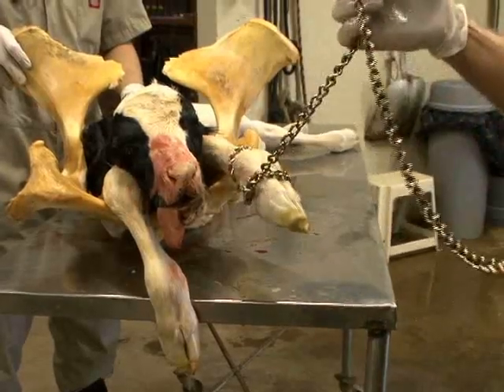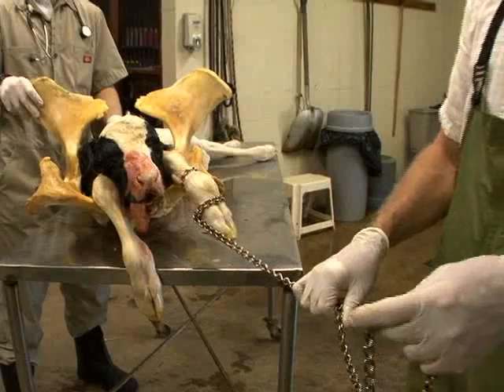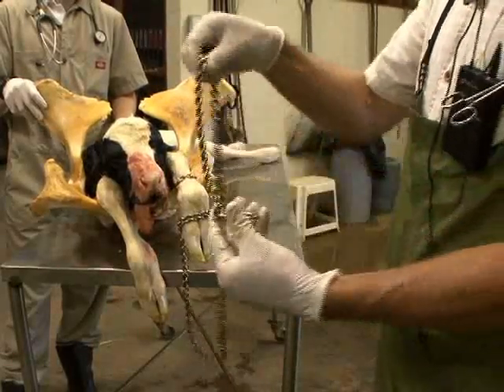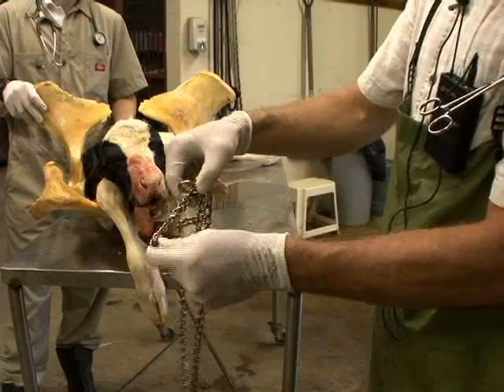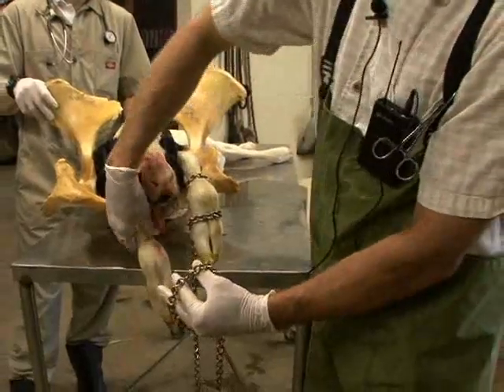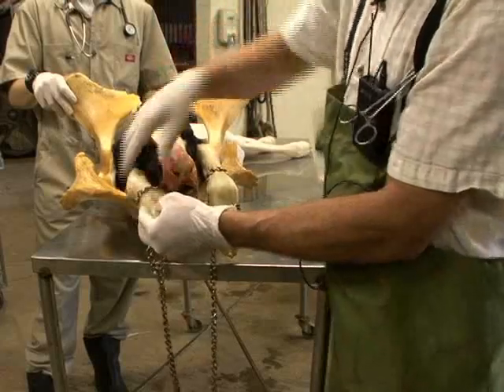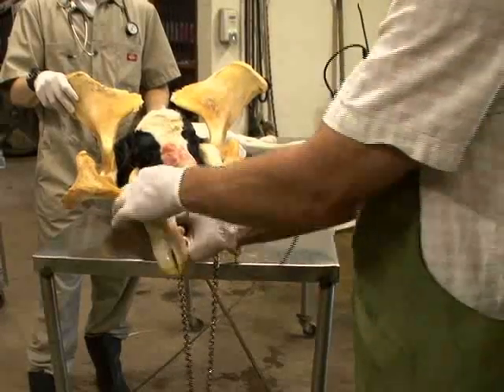If you have a very lengthy OB chain, you can use one chain to place OB chains correctly on both legs. To do that, create another loop at the other end of the chain by holding the larger loop and allowing the chain to slide down through it, creating a second opening. You then apply that to the calf's second leg, identifying the leg, passing the chain over the foot, placing it right at the metacarpal area, and gently pulling down until it's nice and snug against the distal metacarpal.